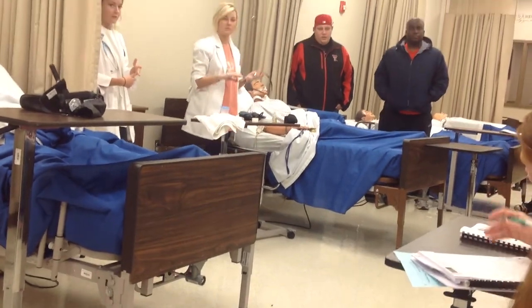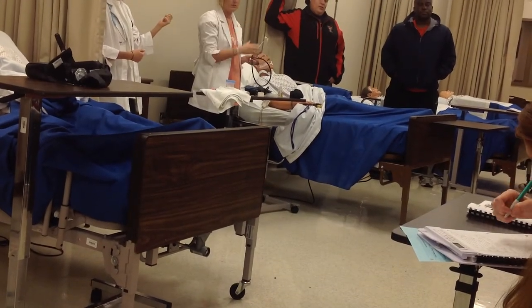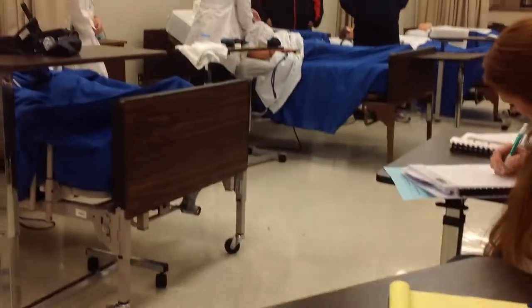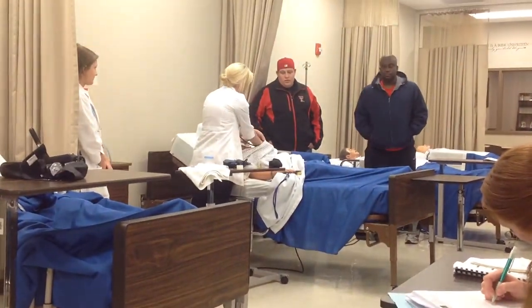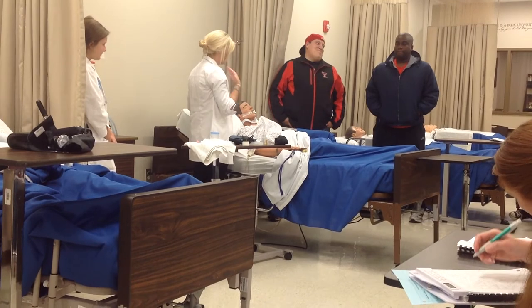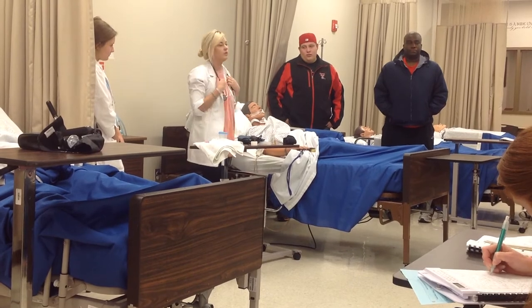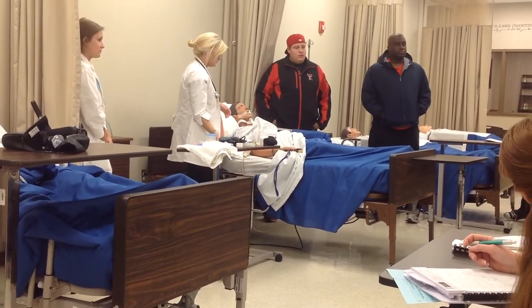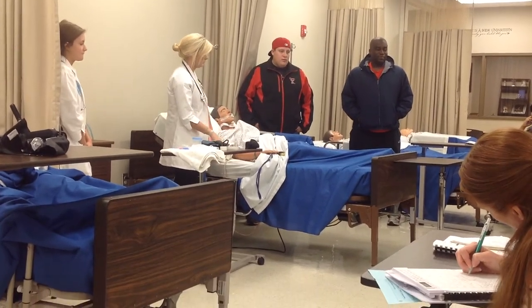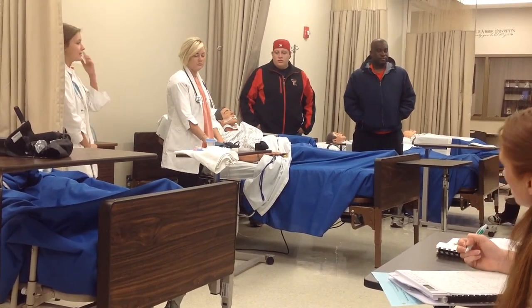What is this device used for? It's for an unconscious patient who can't breathe, if they're choking on their tongue. It keeps the tongue in place. So now you're going to want to do your lung sounds, because your oral airway has to be changed at least once a day, so that's how long you know.